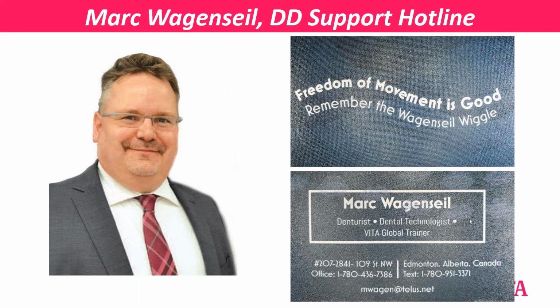So yes, we've been misdiagnosing this, and that's why we run to a reline too quickly. And if you reline it when it doesn't need it, you're going to bugger it up even more. That's, again, my gray hair teaching me that lesson, where I've done more damage by relining it than by going after the root cause, which was the occlusion.